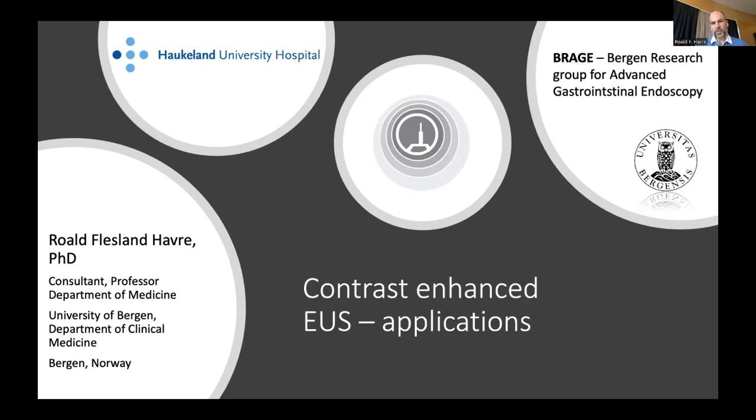So my task today, and thank you for the invitation, is to speak about contrast-enhanced EUS. This is something that we have been working with and have some experience with now, but we have not published anything. So I will speak from my experiences, and as you will see from the images and videos I will show you, it's not always perfect and it's sometimes difficult, but I think this is a part of the learning curve. So maybe you will enjoy that too.